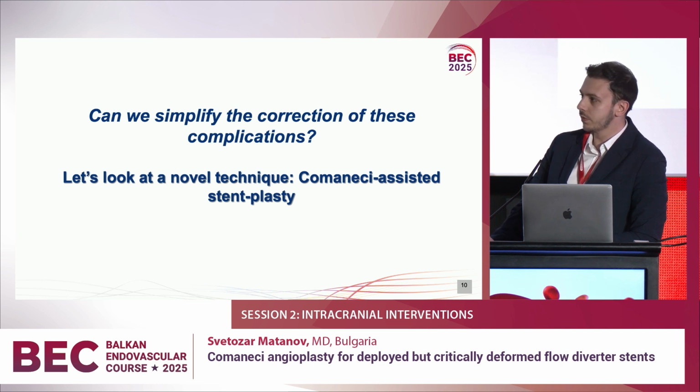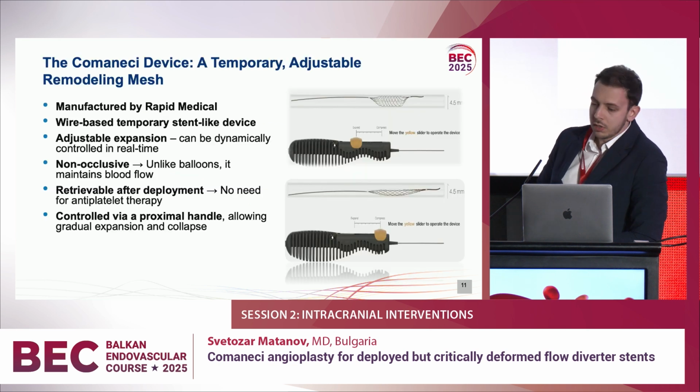But what if you have a device that can be applied with a focal radial force, which is retrievable and doesn't occlude the artery? Now let's talk about Comaneci. You may know what Comaneci is. Comaneci is a device manufactured by Rapid Medical. It's a wire-based stent-like device.